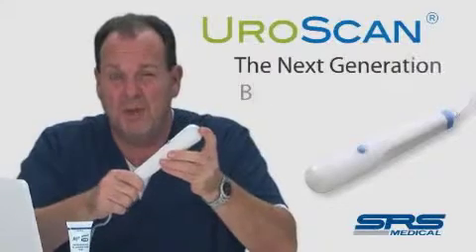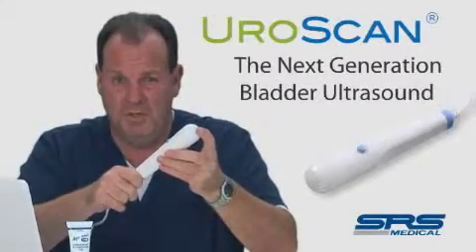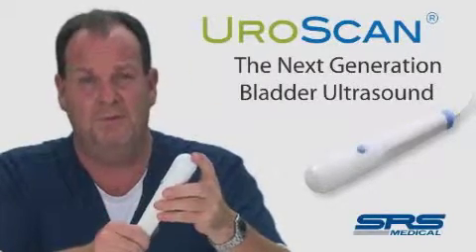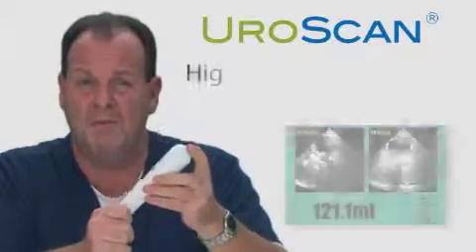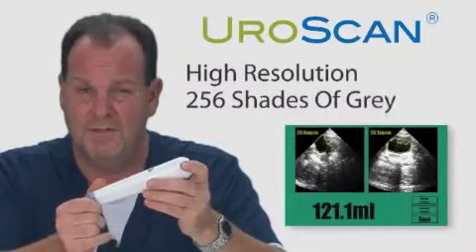The UroScan represents the next generation of bladder volume imaging. All bladder ultrasound devices provide automated bladder volume to the user, but the UroScan does it with high resolution — 256 shades of gray.